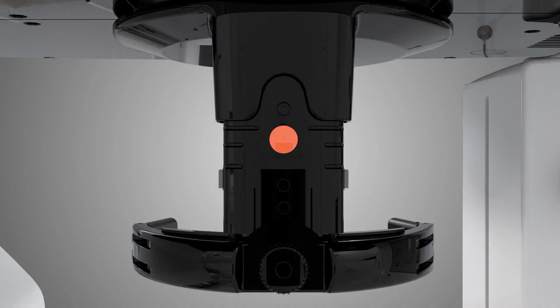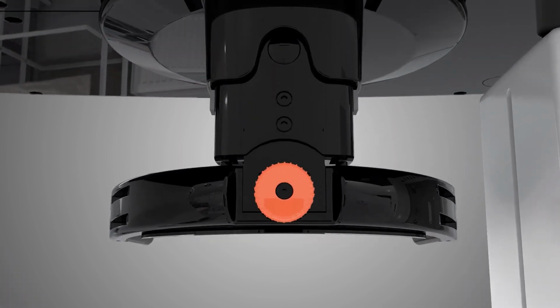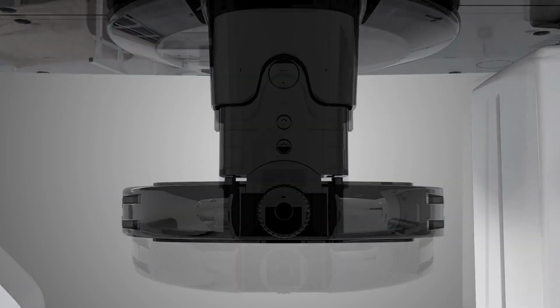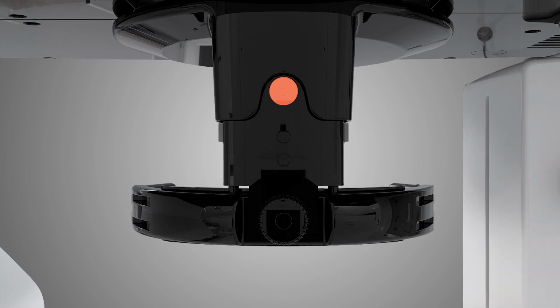Adjust the height of the temple support by pressing the Temple Support Height Adjustment button. Next, open the temple supports by turning the adjustment knob counterclockwise. Ensure the temple support is in the topmost position for an adult pan. The lower positions are for pediatric pan images only. The buttons will re-engage when the desired height is achieved.